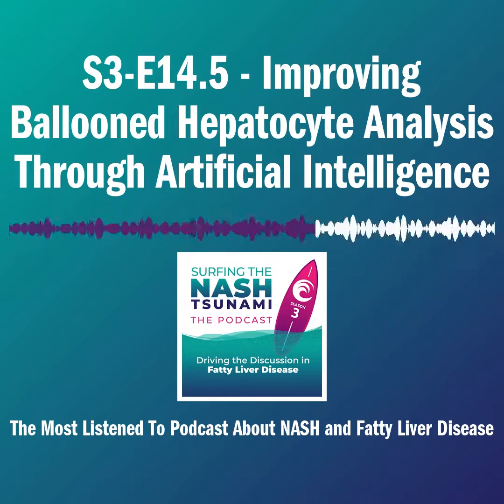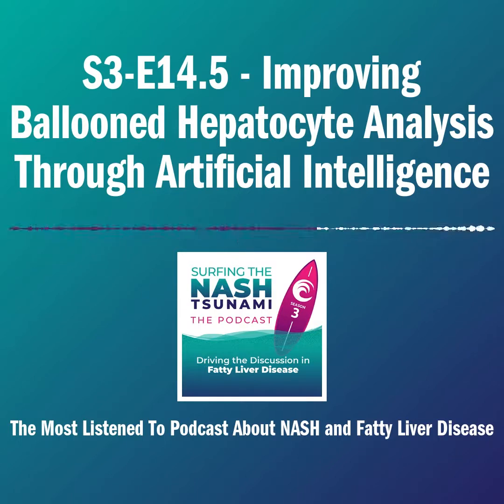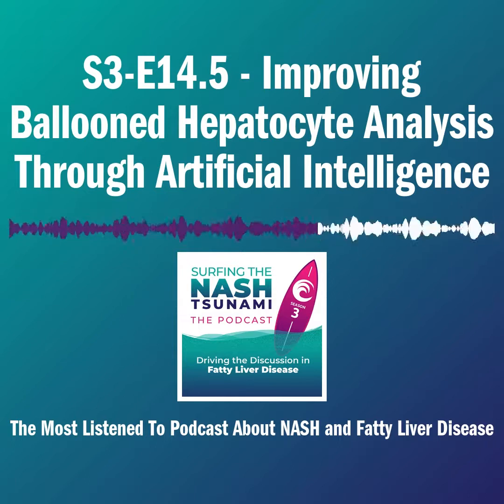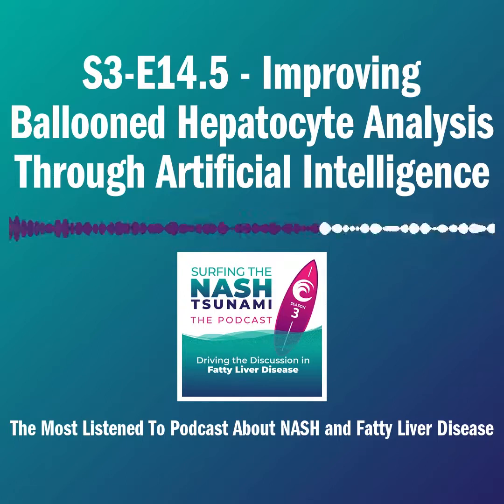And importantly and finally, changes in the SNOF score correlated with changes of portal pressure of more than 20%, which a lot of people use as a measurement point to see if HVPG is changing, and it distinguished those changes with an area under the curve of 0.89.